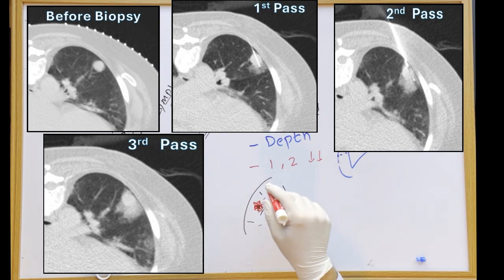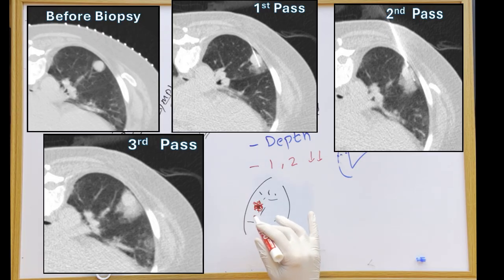That's why, as I mentioned, you should take your time with the first and second samples, as they offer the best chance for accurate lesion targeting. After that, a lot of changes occur that make visualization of the lesion challenging.